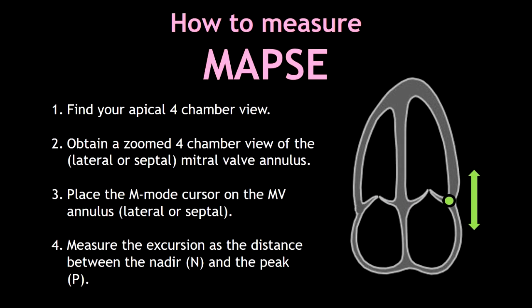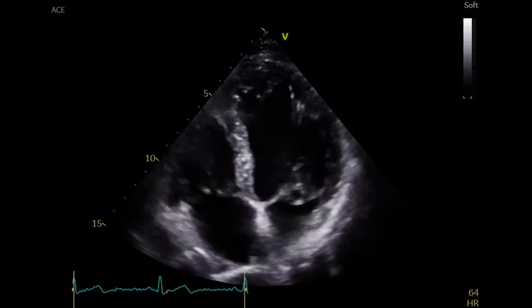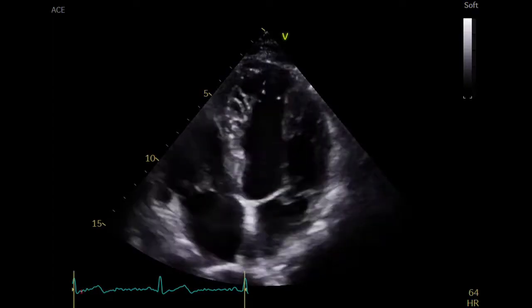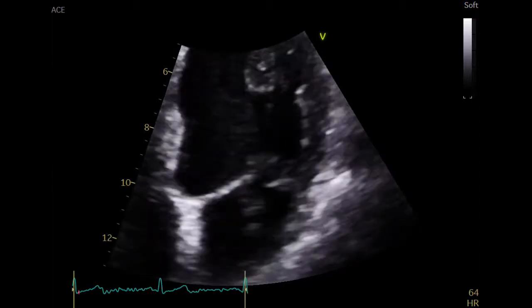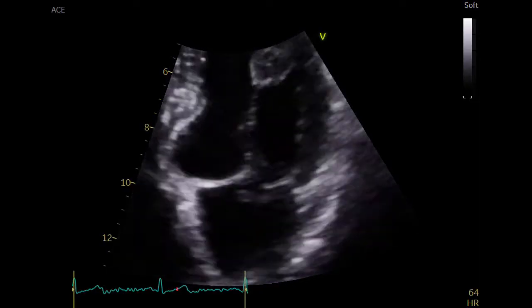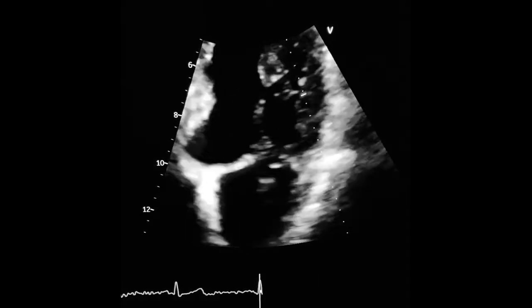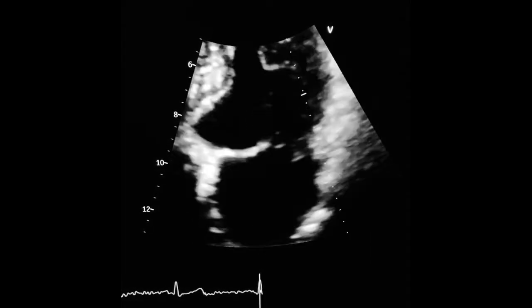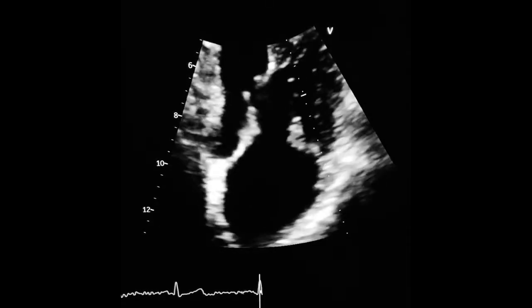Here you can see step by step how to measure your MAPSE. I'm going to show you how to do it properly in your echocardiogram. Measuring MAPSE is very simple. The first thing you have to do is find your apical four chamber view. Now obtain a zoom view of the mitral valve annulus, then place the cursor on the mitral valve annulus and press the M-mode button. In this video, I'm placing the cursor on the lateral mitral valve annulus.